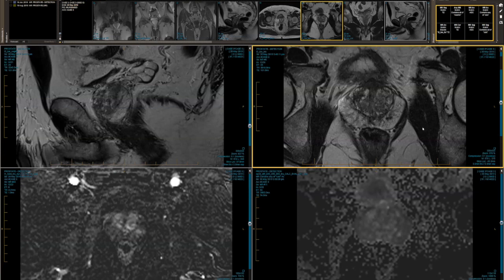So I think it's just food for thought, something to think about. How do we, this disease that we're missing on MR in some cases, does it carry the same clinical significance? Yeah. I'll leave you with that one. I'm glad you brought that up. It kind of seems to argue against doing template biopsies, if that's the case. I'm pretty sure Mark Emberton would argue that that is the rationale for some of the targeted-only biopsies, targeted MR visible lesion treatment based approaches.